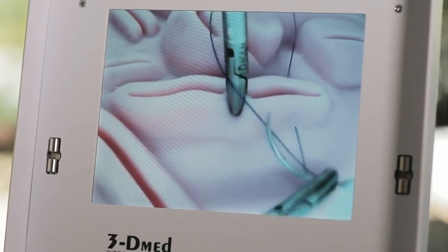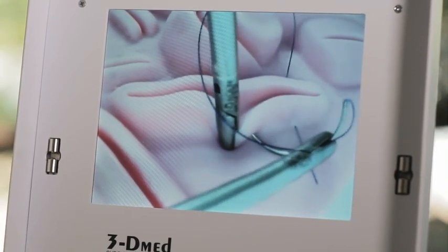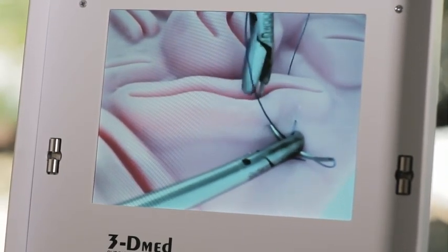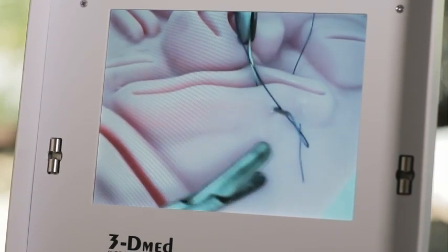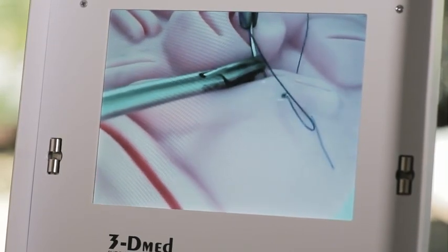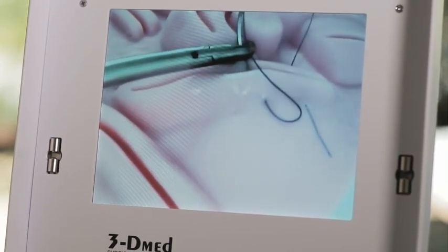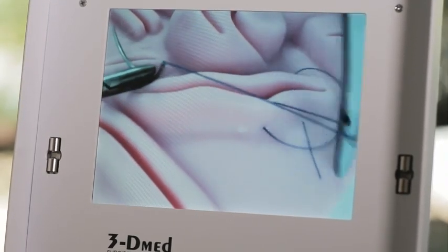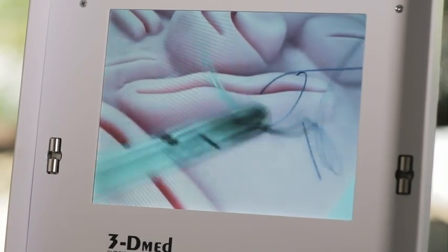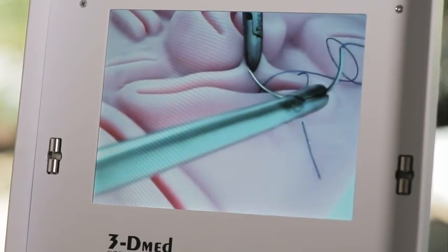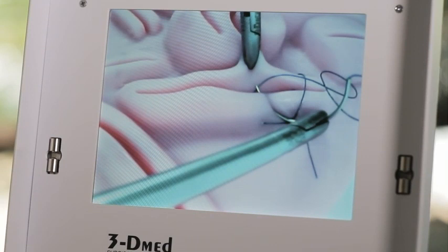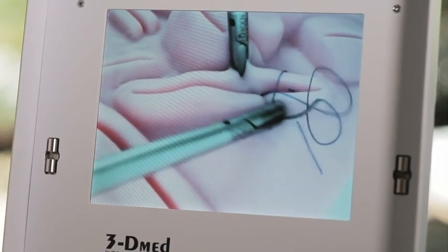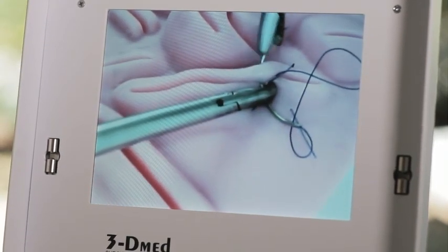Let's continue with this figure-of-eight. We'll pass the suture through, pull it without changing orientation. I will continue to roll it through. We will tighten it because you don't want to be pulling the suture through the entire figure-of-eight. Touch the tissue to know exactly where I am and pass it through.